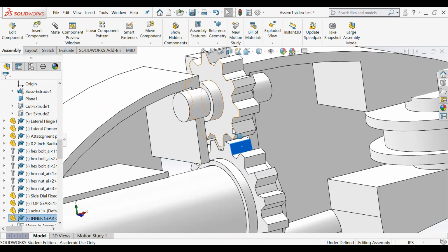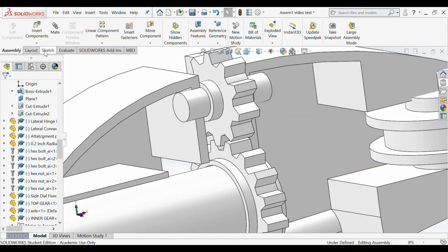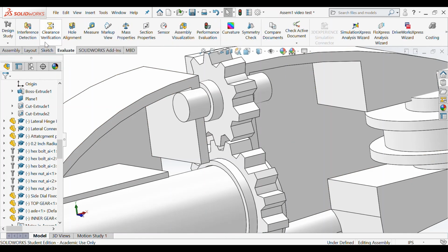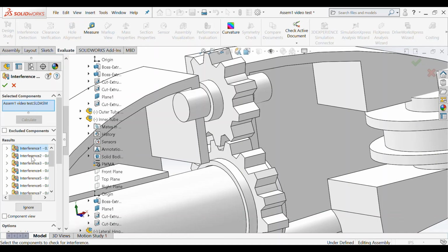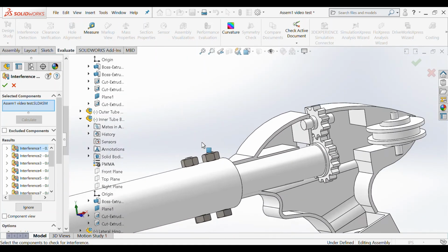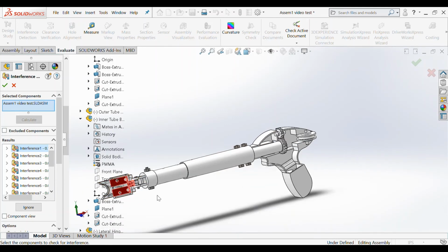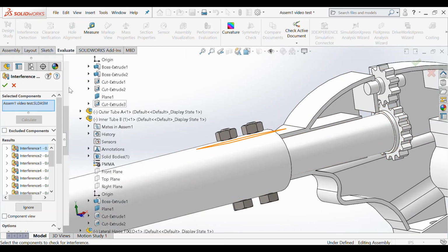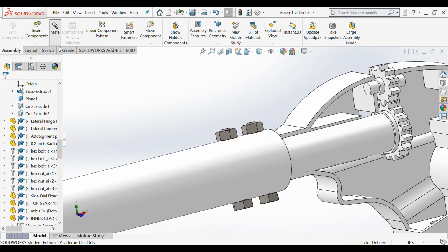So we're going to go on ahead and move them like that. And to check for interference, you go to Evaluate, Interference Detection, and Calculate. So as you can see, there's no interference between these mates. All the interference is down here because we have not fully defined them yet. So we're going to click check and go back to our mate.